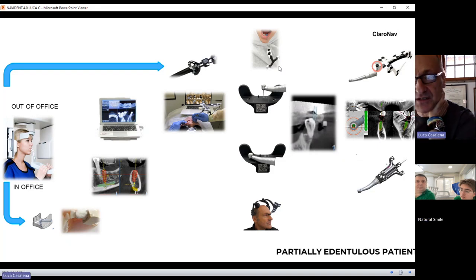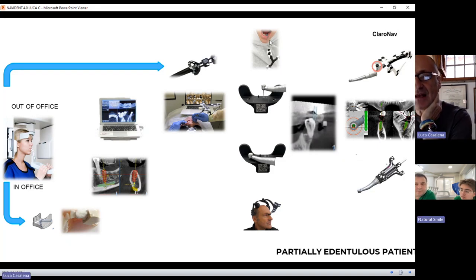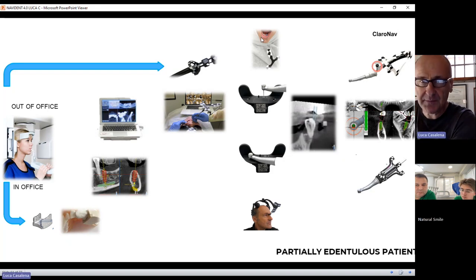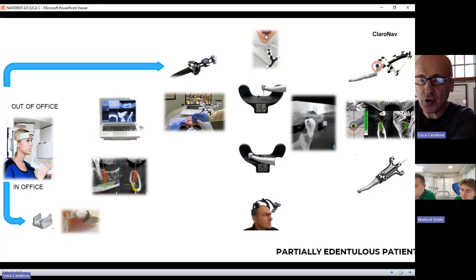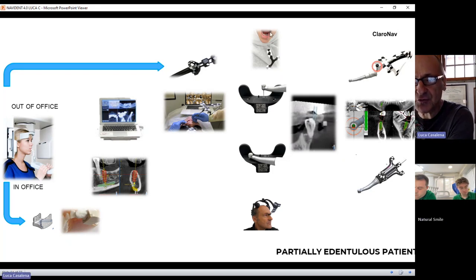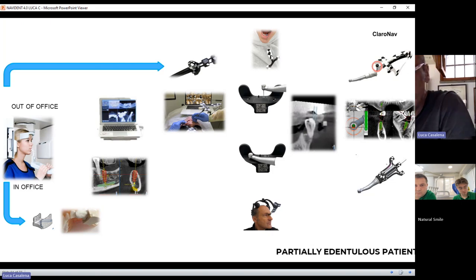What are these optical targets? There are a couple of options. One, like this one, you can light-cure with flow composite. Or there is another one, U-shaped, where you can put liquid silicone for registration. You let it dry, then use it to anchor the optical target on the patient's jaw.